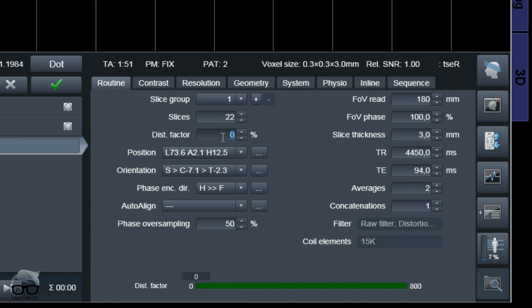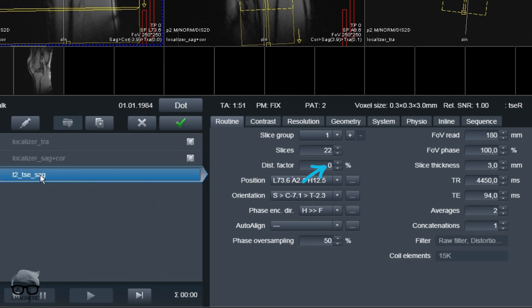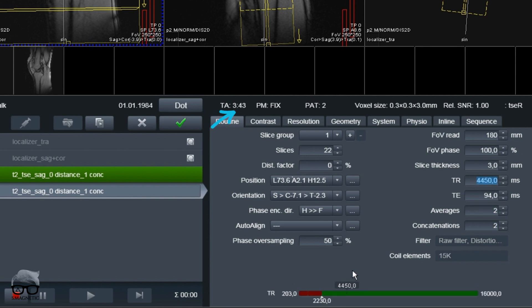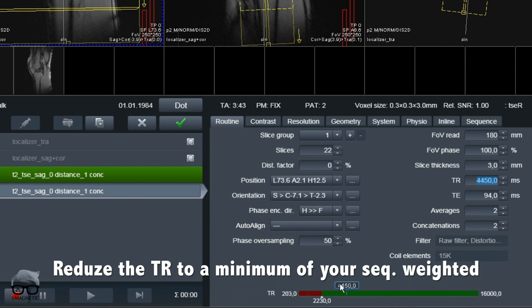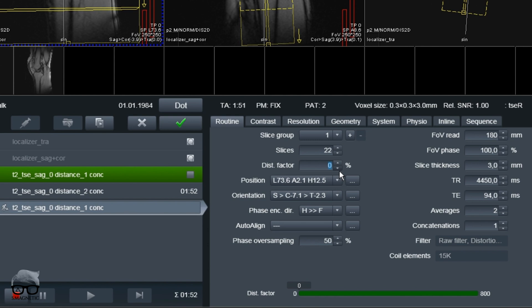I'll reduce the TR so we're at around 1 minute and 51 seconds. We're gonna start with zero distance factor and one concatenation. The next thing we're gonna do is increase to two concatenations and look at the scan time — it doubles, which means you are running two acquisitions. Since we're on a T2 with a restore pulse on, I'm just gonna reduce the TR to get the time approximately the same. And then I'm also gonna keep zero distance factor.